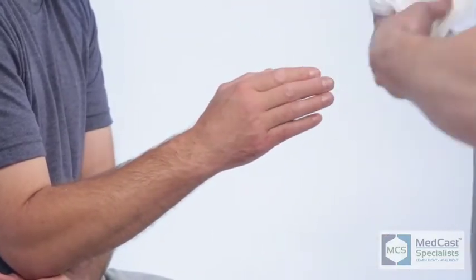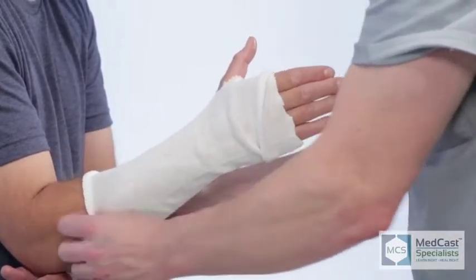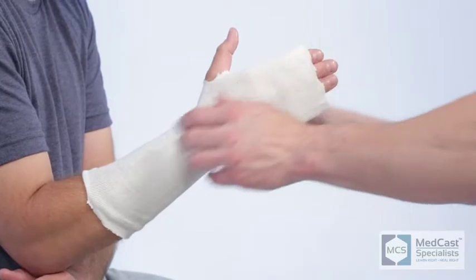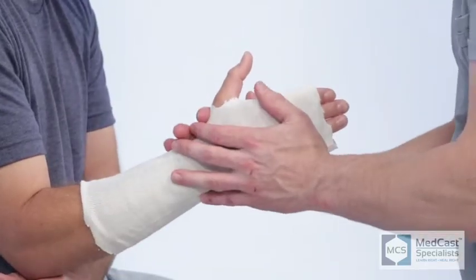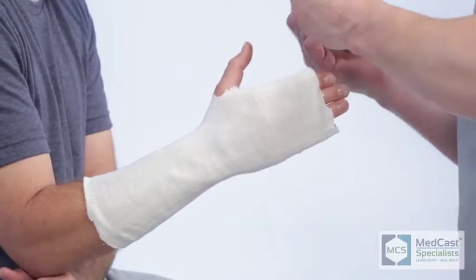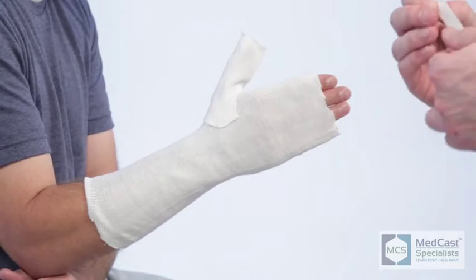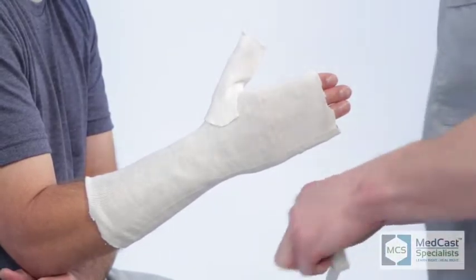For radial gutters and ulnar gutters, we always set it up as if we're doing a short arm cast. So we're gonna pat it. And for radial gutters, the injury is gonna be in the fingers or the metacarpals, so you don't need to go as high proximally on the forearm. Usually mid forearm is adequate for about anything that you're treating for this cast.